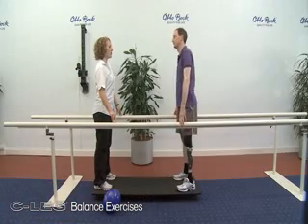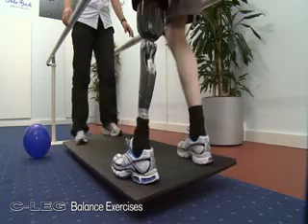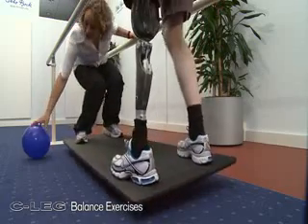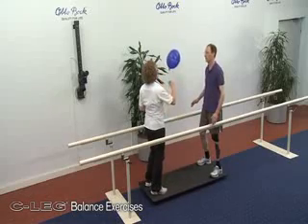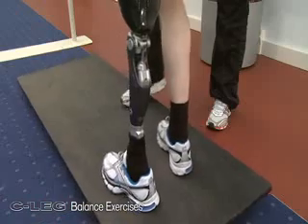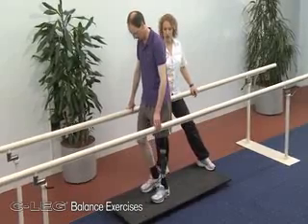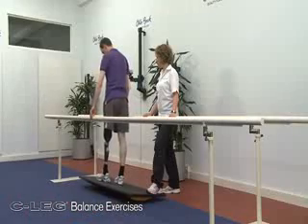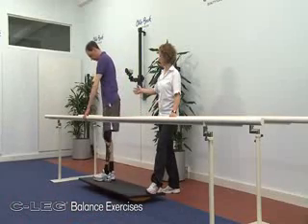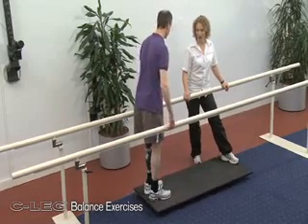The rocker board offers many options for supporting leg training. After the amputee learns how to stand on it securely, various challenges can be added. The rocker board should first be positioned between parallel bars and then away from any supports. Walking on the rocker board is an excellent exercise in order to learn how to maintain balance on the prosthesis and correctly assess the available ground clearance.